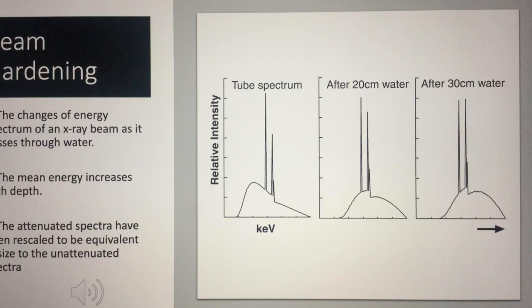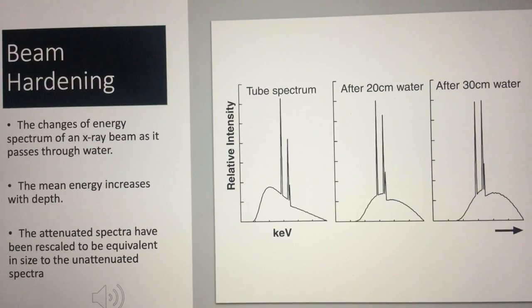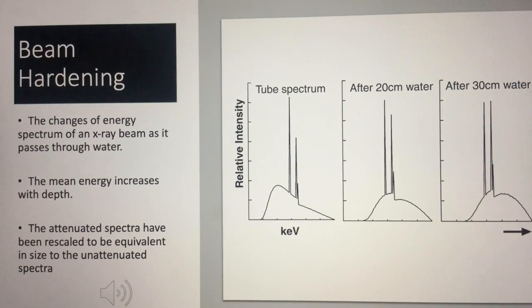That means the soft X-rays produced will get absorbed at the skin surface and do not contribute to image formation. Instead, they contribute to a higher skin dose. Beam hardening is required to remove soft X-rays and harden the beam so that it has sufficient energy to penetrate the patient.